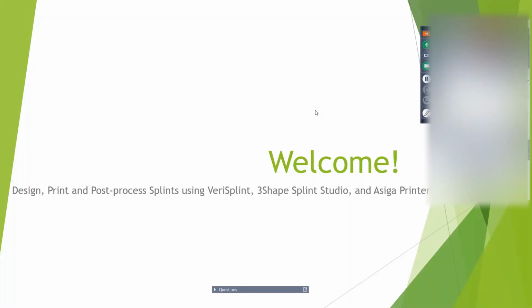A lot of you may have already seen that 3Shape has released it. Today we're going to take a dive into it and give a formal introduction.